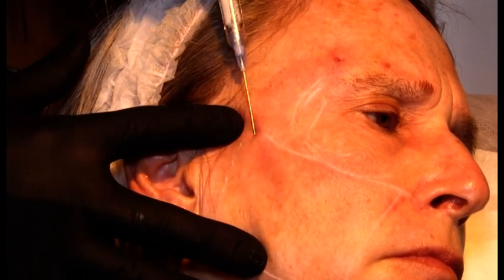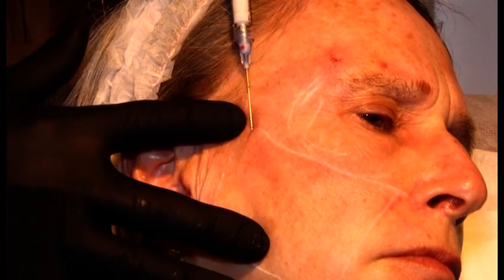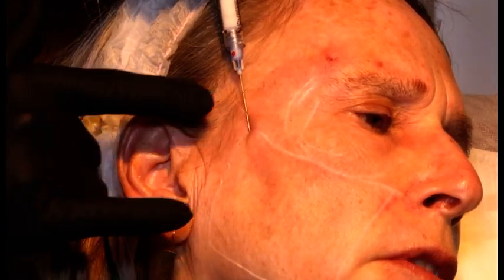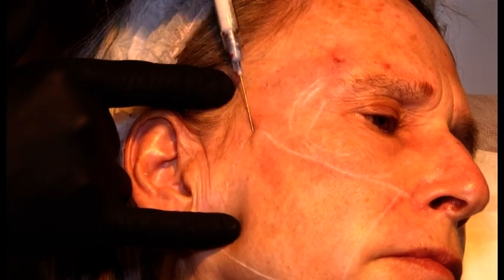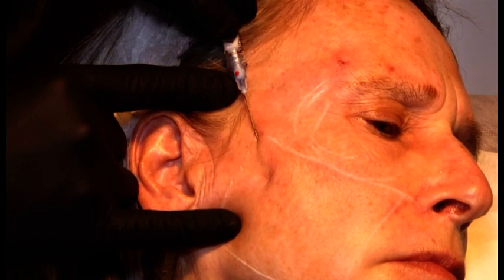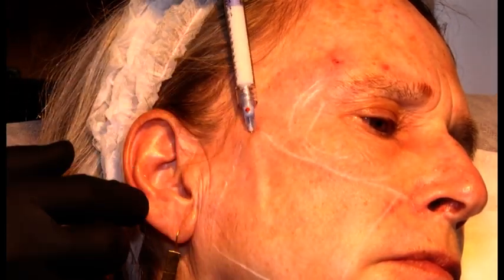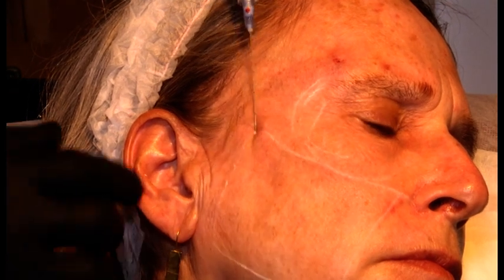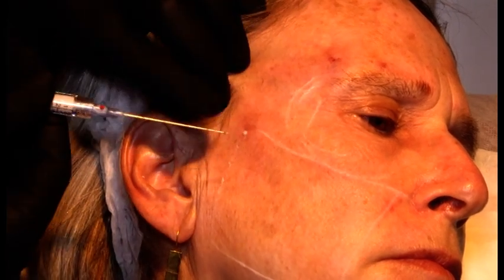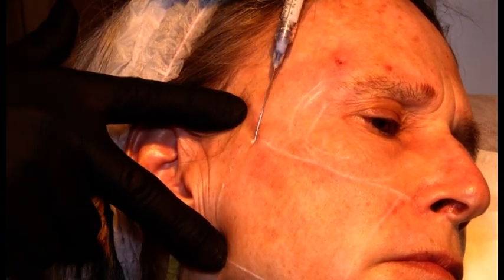So when you come down here, this is where we have the zygomatic retaining ligament inserting into the skin. So there's definitely some resistance. So I kind of rotate and push the cannula up and down until it finds its way past those resistances. I move down.